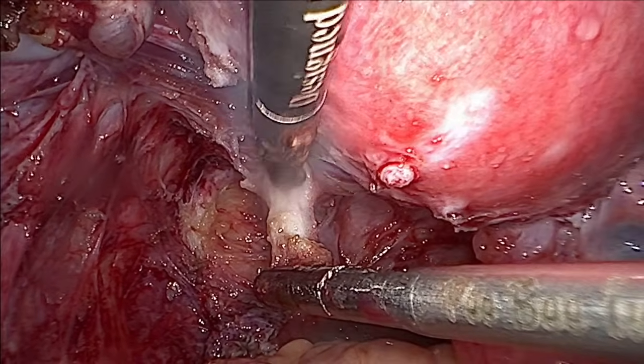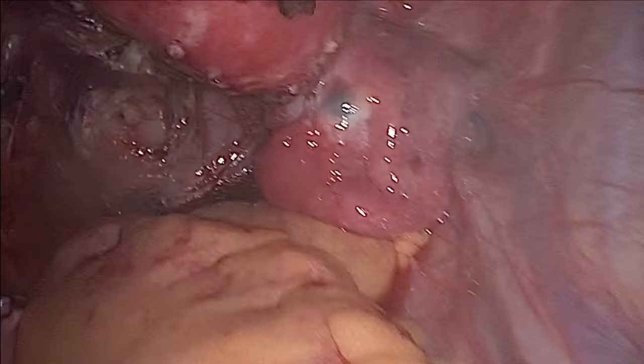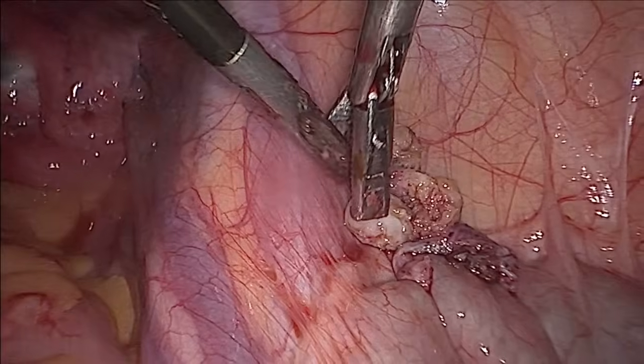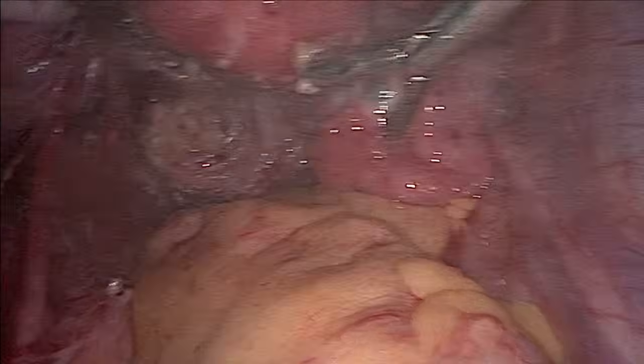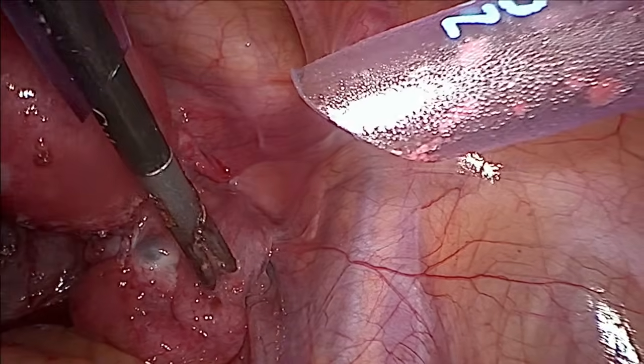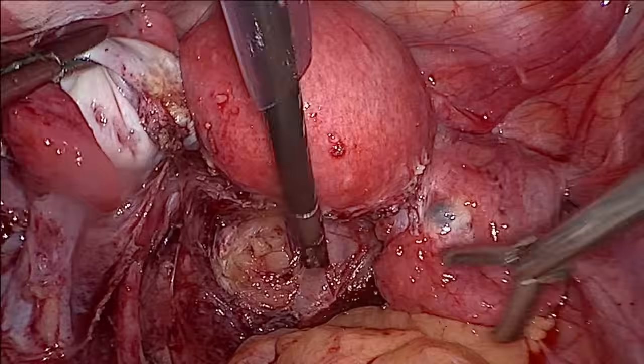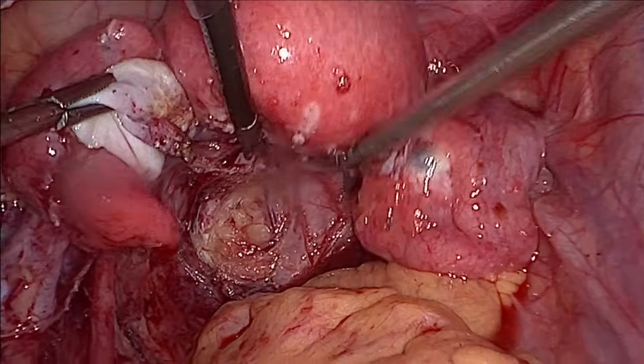Okay, stick close to the nodule. No need to go and shave off the cervix. Okay, I think we can remove this nodule. Okay, so the left part is done.